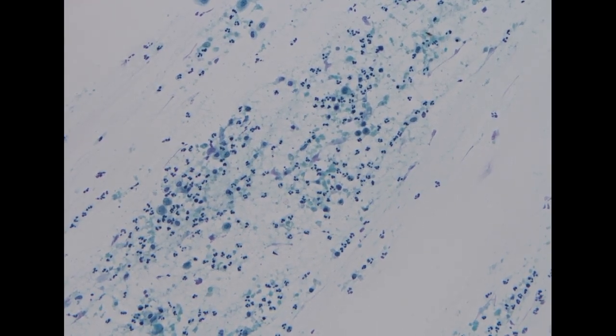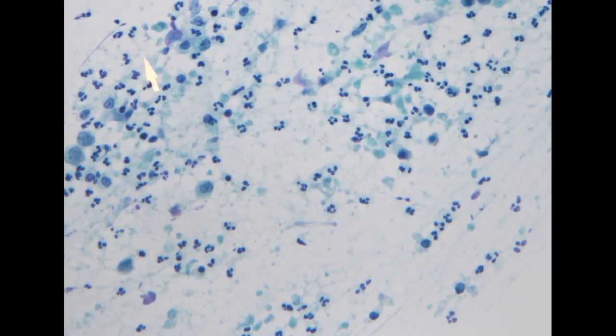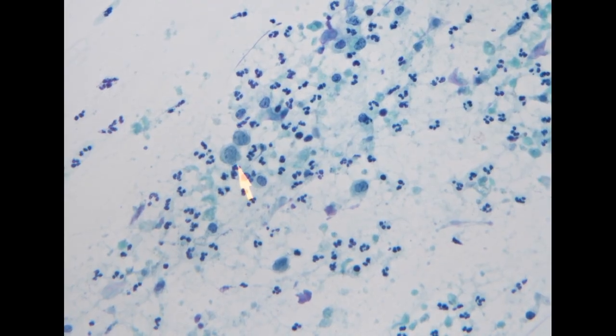Usually in the conventional smear, it goes in the same direction, the smearing direction, and you can find some granular debris admixed with neutrophils, as well as some histiocytoid plasmacytoid cells, which are most likely a stromal component of endometrium.